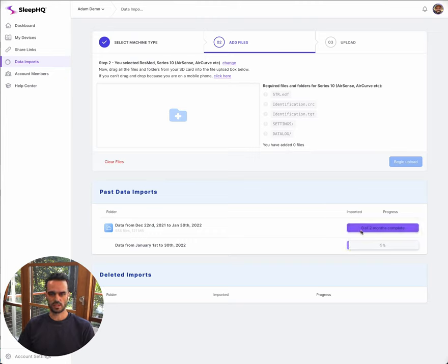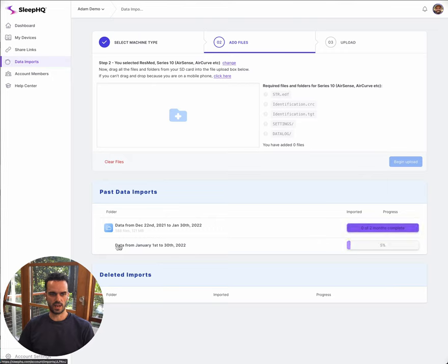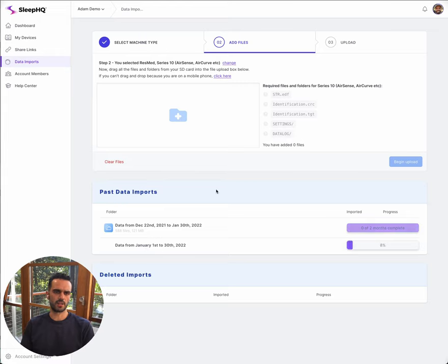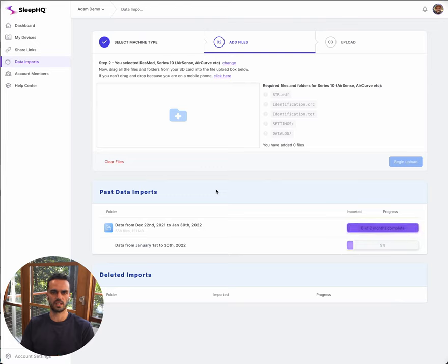You can see the progress of it down here. What it will do is break your data up into chunks. Right now my data is being processed from January 1st. It does it in about one month chunks, just depending on the machine you've got and how much data you're adding. So that's going to process in the background for me.